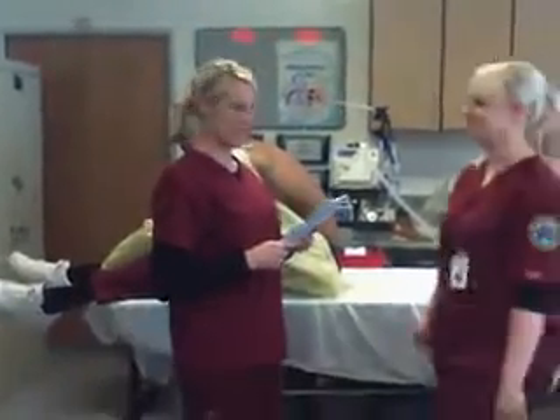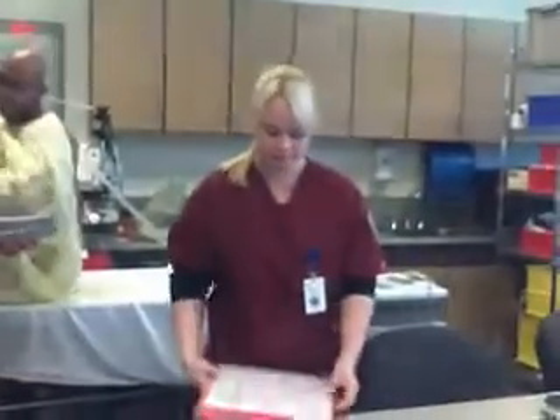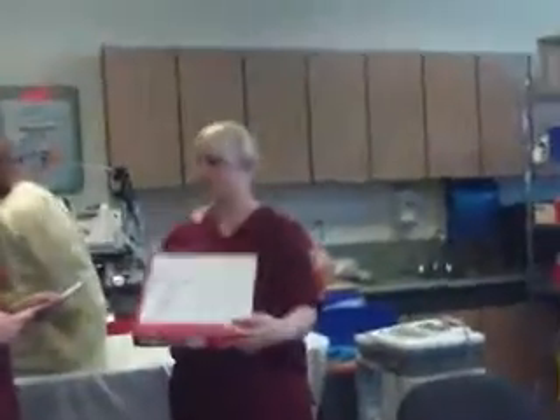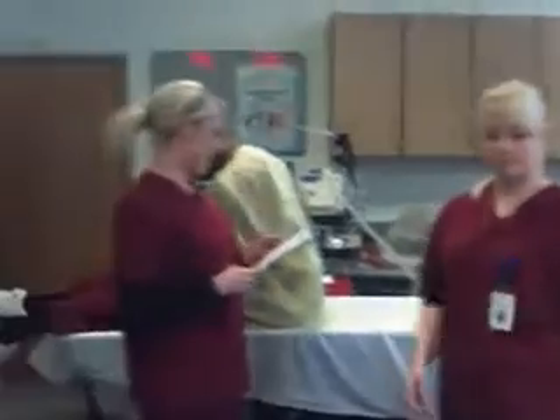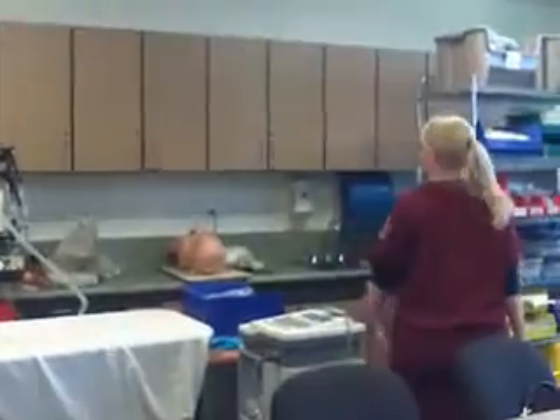We're going to do an EKG on our patient. The first step is to verify the order. The next step is to maintain asepsis, which is washing your hands and putting on gloves.